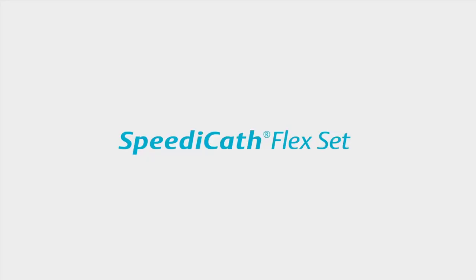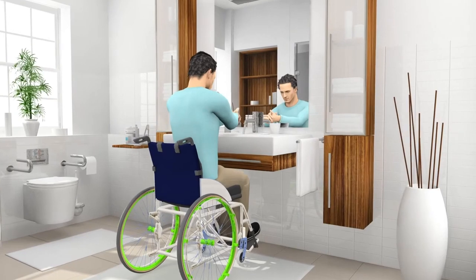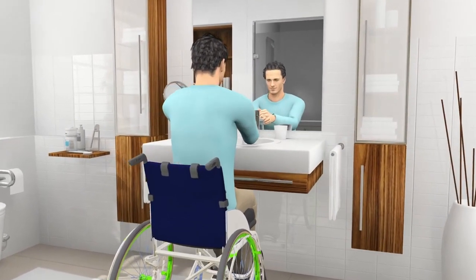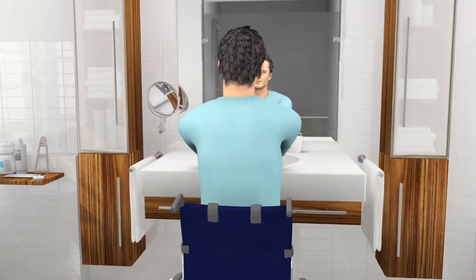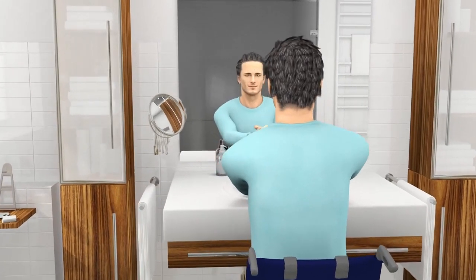In this film, you will learn, step by step, how to empty your bladder. It's relatively simple, but will require some practice. Start by washing your hands thoroughly with water and soap. Remember also to wash your thumbs. Alcohol hand gel can be used if you don't have access to washing facilities.